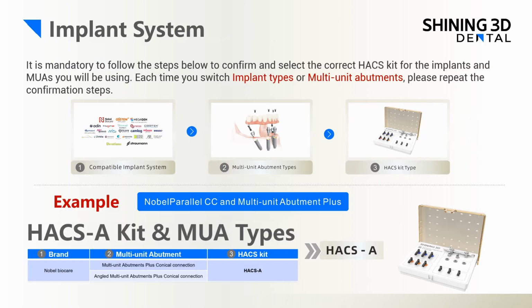Please make sure you follow the steps below to confirm and select the correct high-accuracy coded scan body kit for the implants and the multi-unit abutments you will be using. Each time you switch implant types or multi-unit abutments, please repeat the confirmation steps.